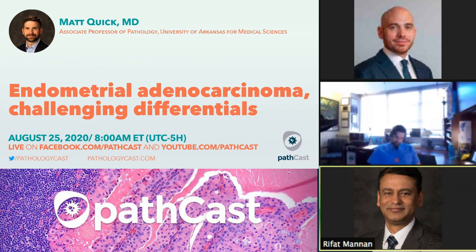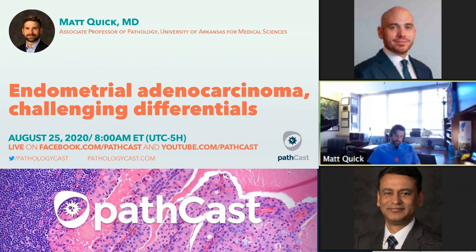Thank you, Dr. Quick. Here is another question. This is from Kalyani. How does INI1 help in dedifferentiated versus undifferentiated? I don't think that it can help you discern a dedifferentiated from an undifferentiated carcinoma. It will, or it can occasionally identify a case of undiff, d-diff, if your immunostains aren't helping.